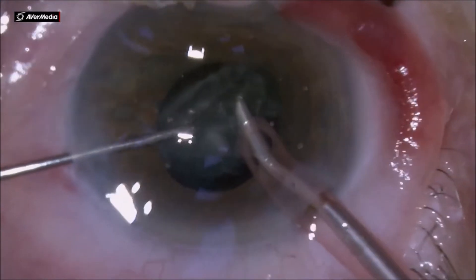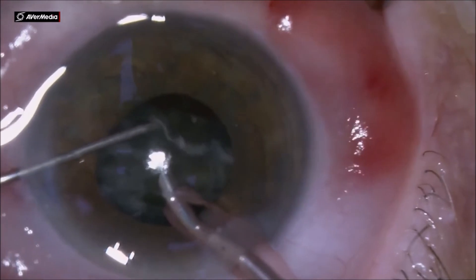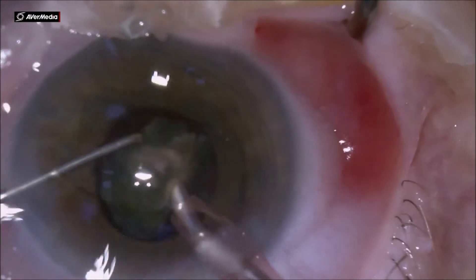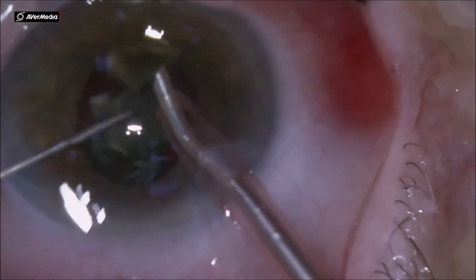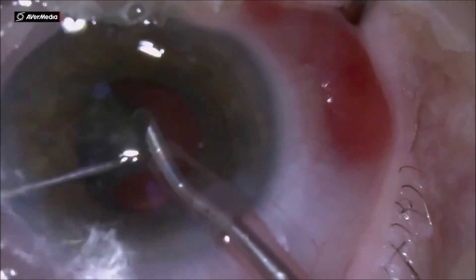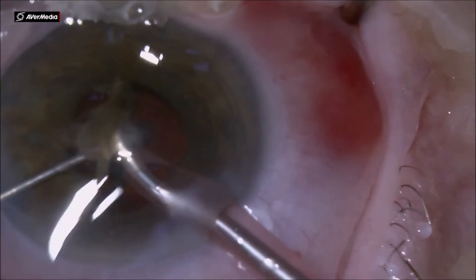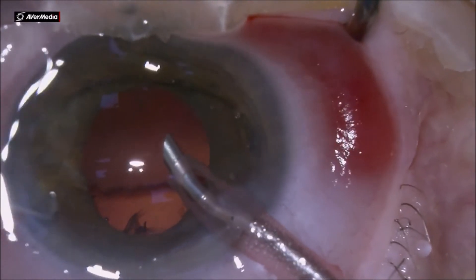I am going to push the remaining part with the chopper. Having the posterior plate divided all the way through made the phaco emulsification a little bit faster and easier. Keeping the phaco needle at the middle of the pupil and feeding up the pieces with the chopper, continuously chopping the pieces to have smaller and smaller pieces for emulsification — this will get you a clear cornea the next day.